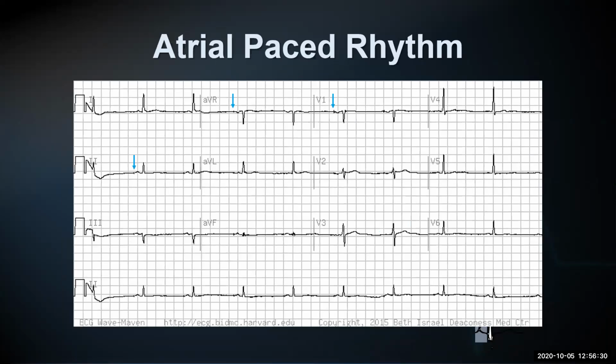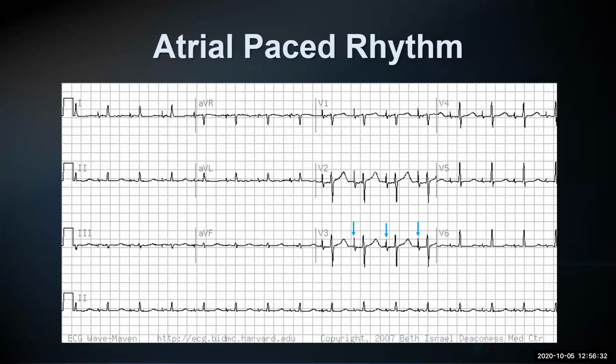In an atrial paced rhythm, oh, I thought I had boxes here, but I didn't. You can see that when you have these long, perfectly perpendicular spikes, it's suggestive of an atrial paced rhythm. I just put that in there so you guys know, just to be complete, because I didn't think that I had a separate PowerPoint just going over paced rhythms.